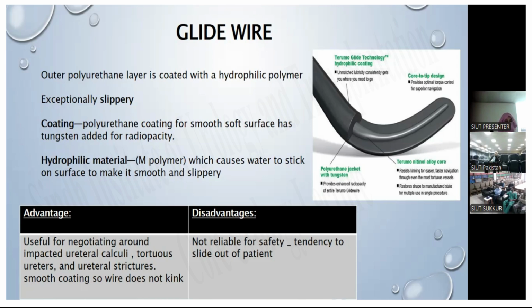So these wires are very important, and to understand the importance of these wires, you've got to know the tip as well as the end, which is the far end. So the tip and the far end, they are different. They are different in design. They are different in coating, perhaps. And for instance, if you flip something which is a J tip, floppy end, to a stiff end, then it will cause a lot of damage. It will cause dissection, which is like submucosal dissection.